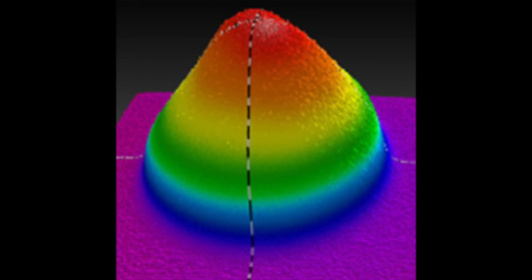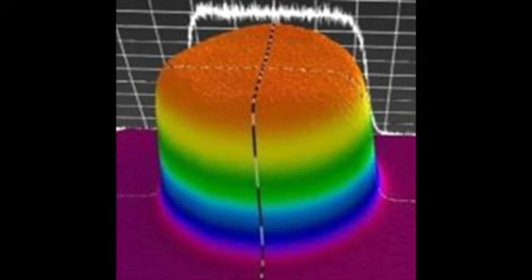This is the beam profile of a traditional crosslinker prior to the Avedro KXL machine, which produced an uneven distribution of UV light across the cornea. The Avedro machine, as you can see here, distributes the light very evenly across the cornea, creating a fantastic and even crosslinking reaction.